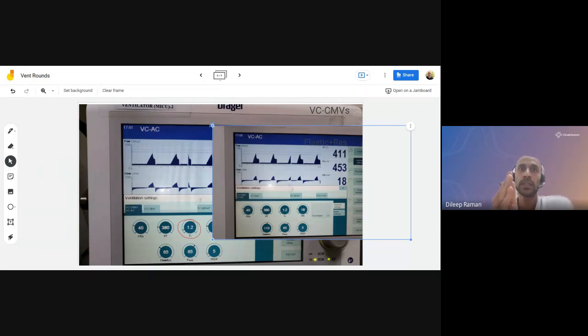Right. So Vibby's question is, is it set point or adaptive? I'll come to that, Vibby, in just a second.